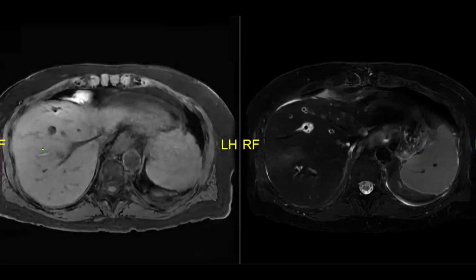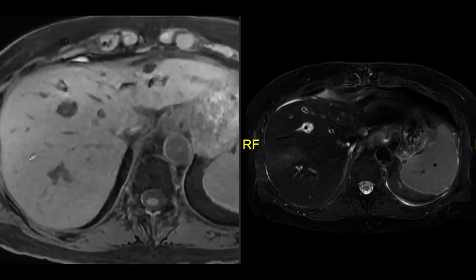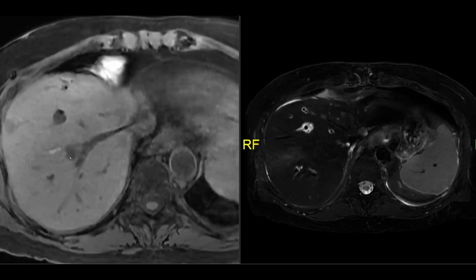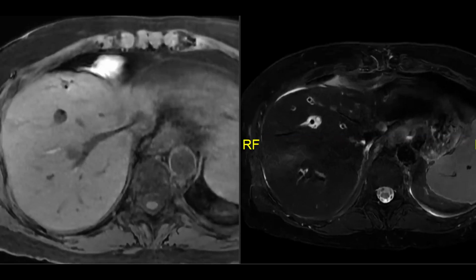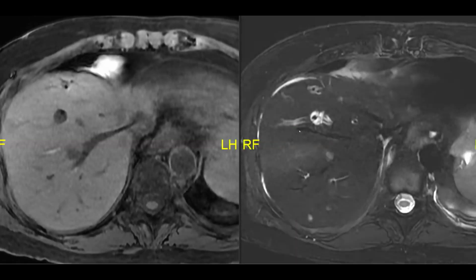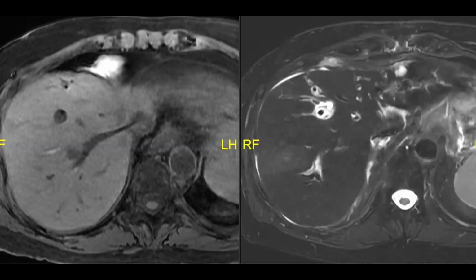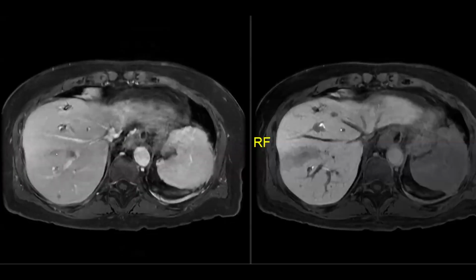You can see nicely, this is the vessel. It's T1 hyperintense, sitting right next to that metastasis. We see intermediate signal on T2, and you can see the parenchyma surrounding the thrombus is kind of edematous, which is not unexpected. And then here's the portal venous phase.